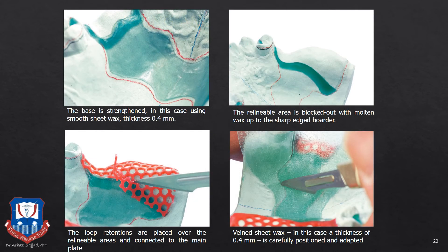First a thin layer of inlay wax or carving wax is spread over the major connector design. This is followed by placement of the mesh or lattice pattern on the area where relief was provided — the minor connector which will hold the acrylic and denture teeth. Then another layer of 20 or 22 gauge casting wax is adapted onto the major connector, which can be a textured or smooth pattern casting wax. Using inlay wax, all the minor connectors, rests, and indirect retainers are fabricated.